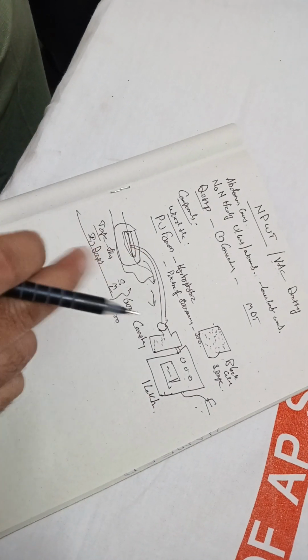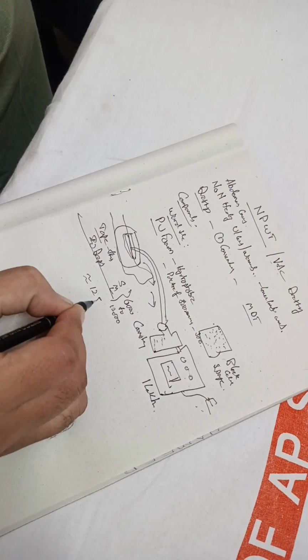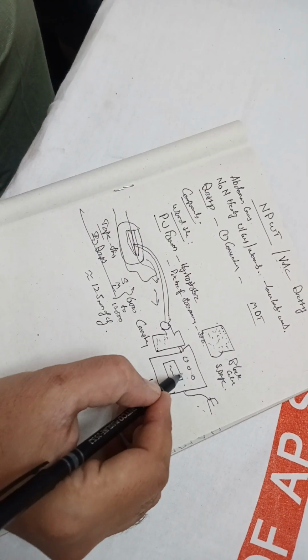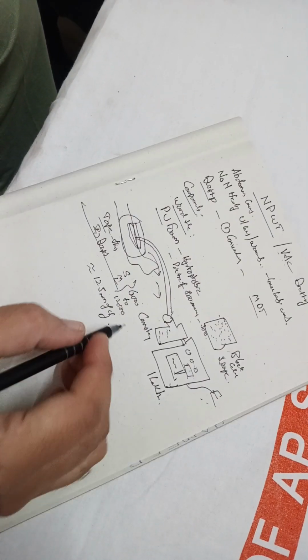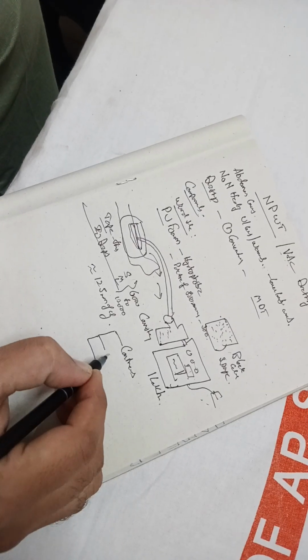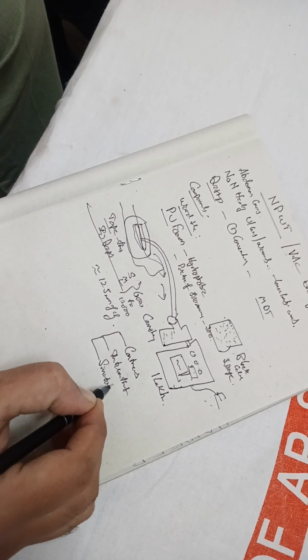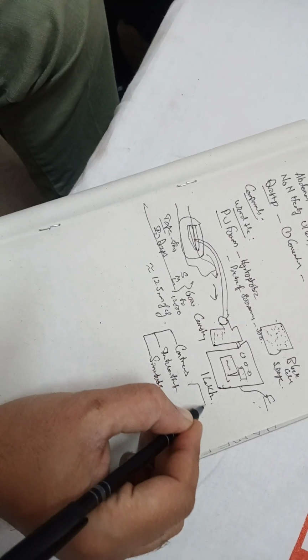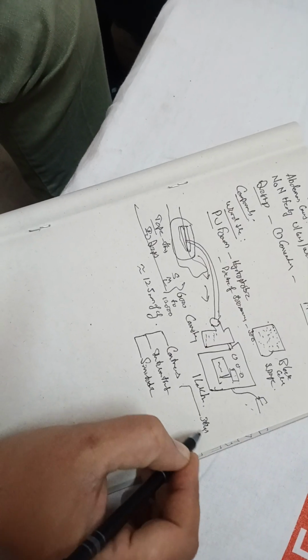Here when we are doing that, you have to maintain a certain pressure. That pressure is approximately 125 mm of Hg. Here the pressure monitor will be there, where you can put the settings, and this pressure can be applied in three different mechanisms. One is continuous, another is intermittent, another is sinusoidal. The name itself suggests, continuous means the pressure will increase and it will maintain like that throughout the sitting, whether it is 36 hours or 48 hours.